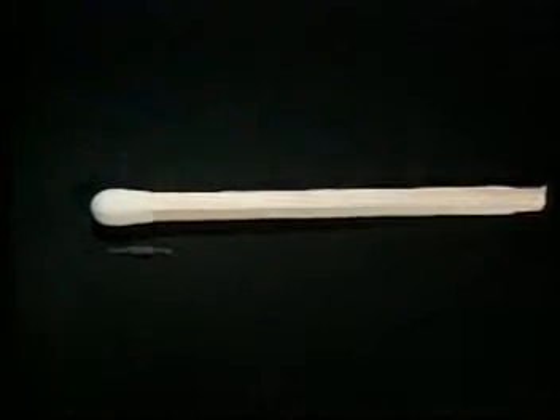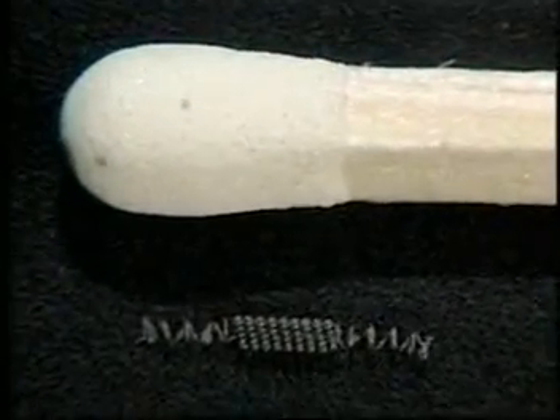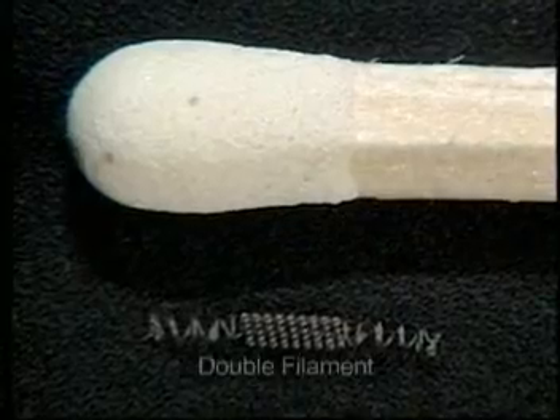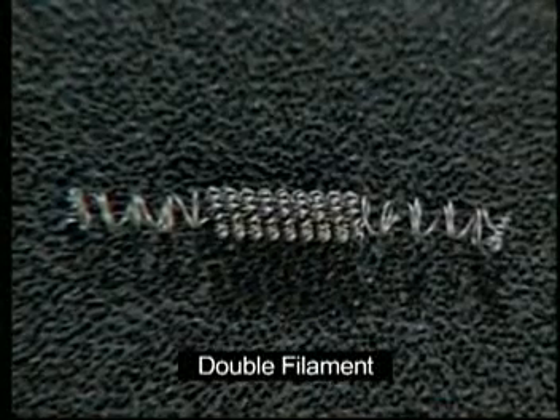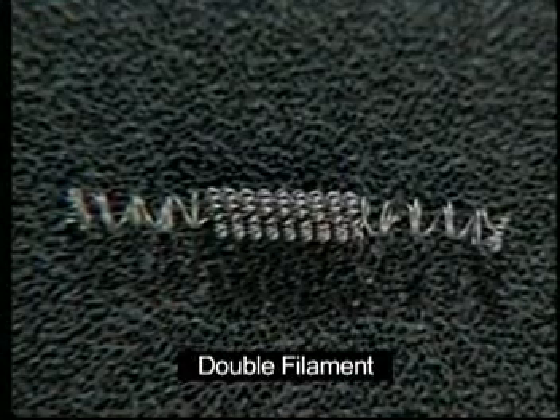Mr. Maruyama started working on the request, but soon realized that Mr. Sugaumi wanted nothing less than a perfect solution. However, to create a small lamp with very high intensity was extremely difficult. After a month of hard work, Mr. Maruyama had an idea: he decided to create a double filament in order to double the electric current. Upon testing it, there was a blinding light.